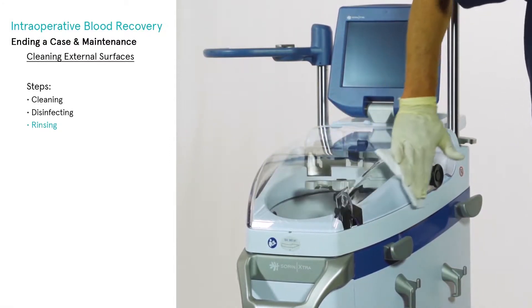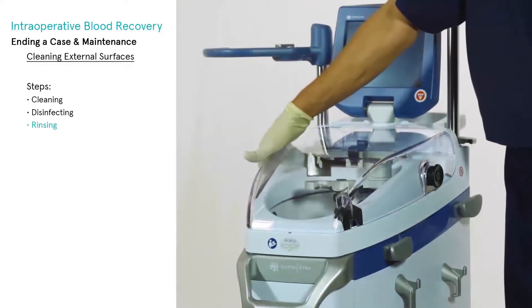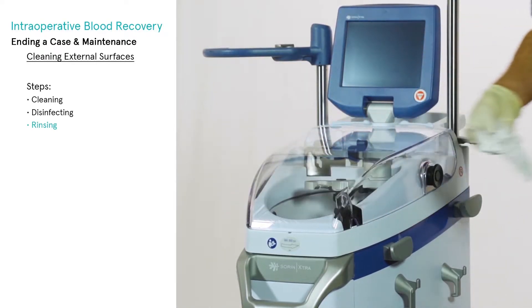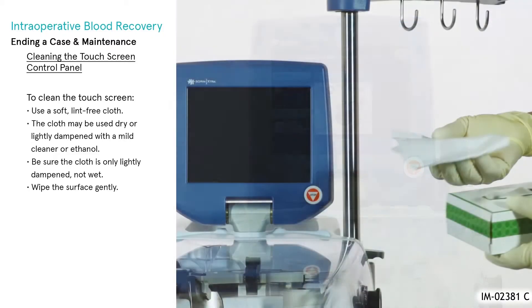Rinse with water and wipe off the disinfectant product. In order to prevent possible damage, comply with the instructions provided by the manufacturer of the product, including required dilution. Read instructions for use and the label of the product carefully.